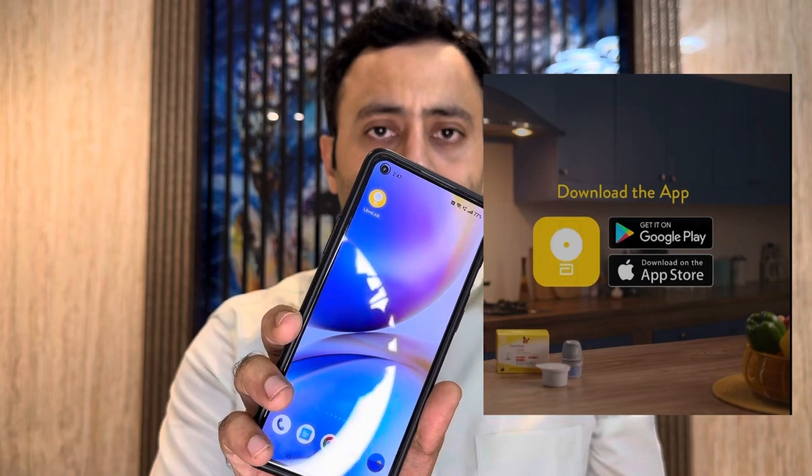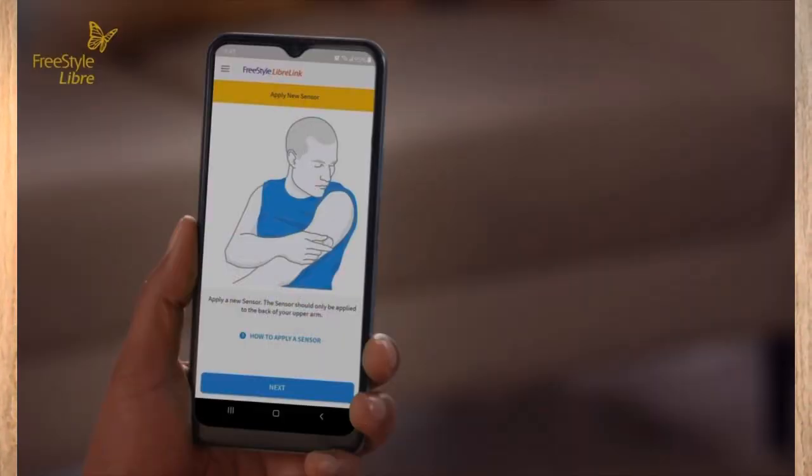Let's see how the LibreLink app looks. This is LibreLink — this is the interface and how it records your readings. It took me around 10 to 15 minutes to download and set it up. You just have to scan the sensor, you'll hear a vibration, and it will automatically record your glucose readings.